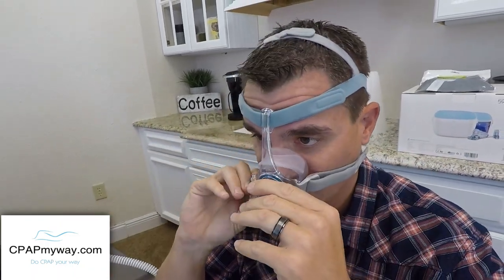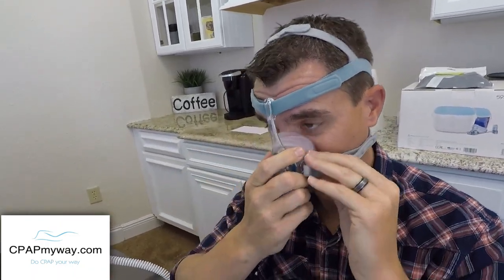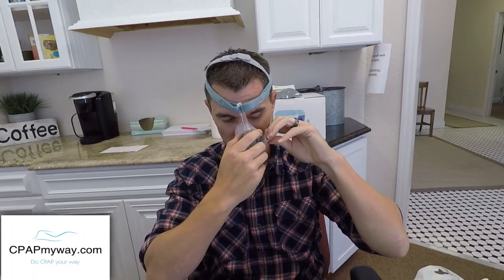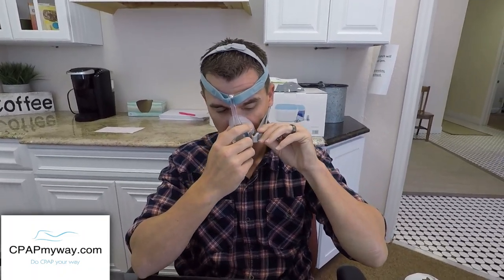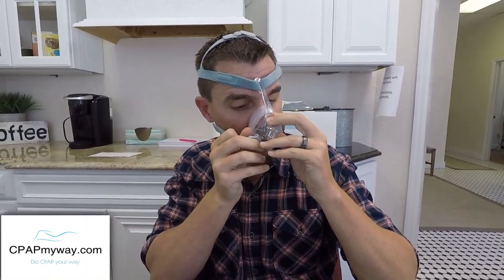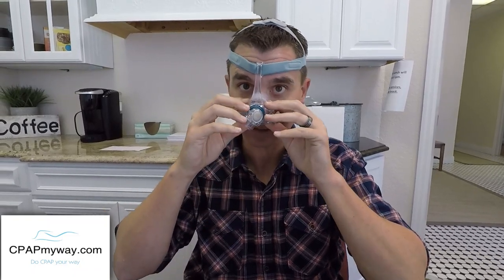I'm a little bit more of a fan of using the clips so that you don't have to drag it over your head. If you're doing that, you just put the headgear on like normal, put it up against your nose, and then, one clip at a time, bring it around and clip it in. I know a lot of old school users just like to drag it right over top of their head, and that's kind of what Fisher and Paykel was thinking when they designed this headgear, so that people could just pull it on and then pull it right back off the exact same way. But you do have the clips that, in my opinion, make it a little easier.